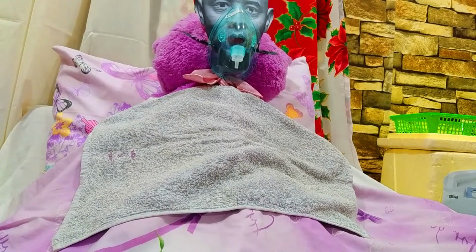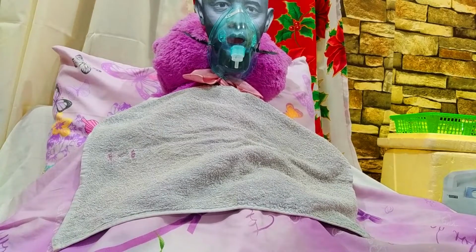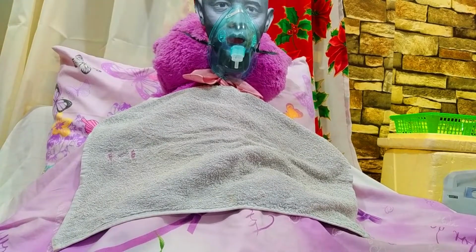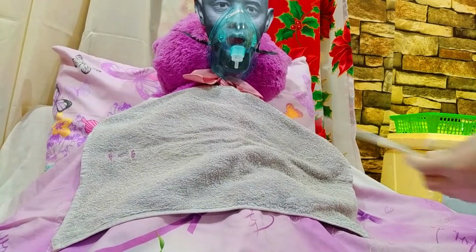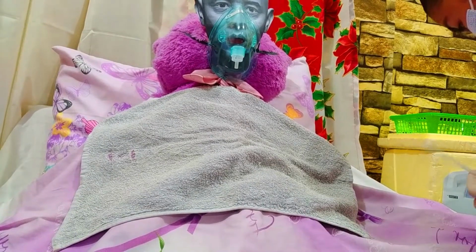And then flush the catheter with saline.